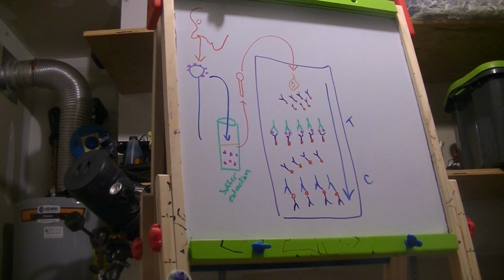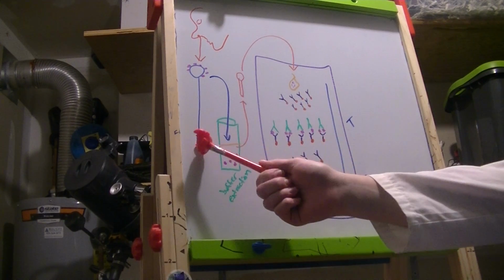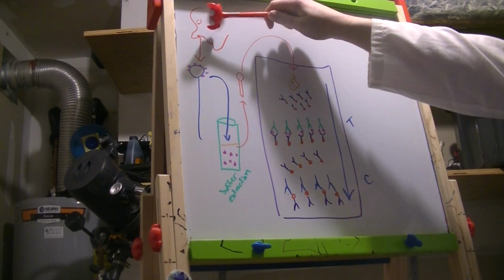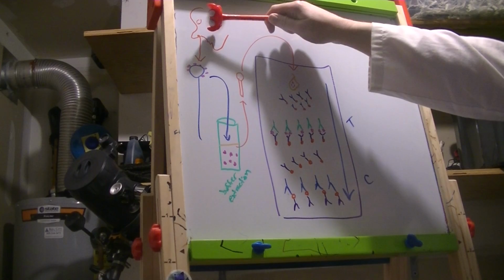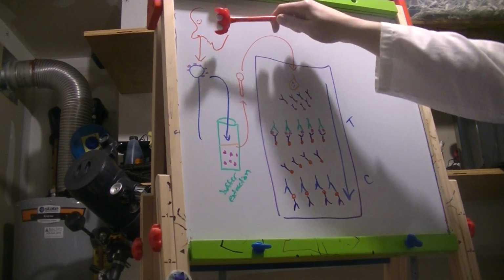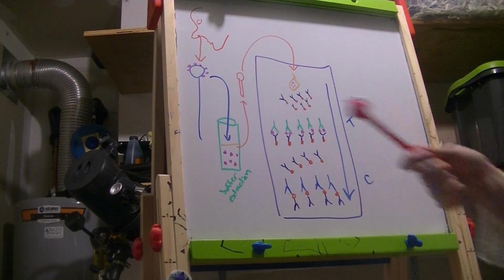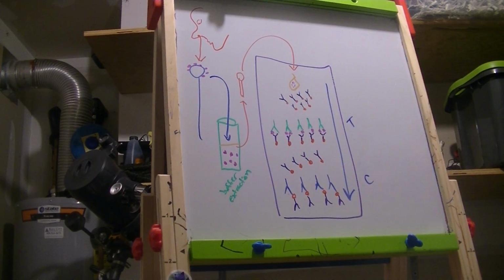This is the explanation of the principle for the flu A and B test we performed in lab. So this is performed on a nasopharyngeal swab, meaning the very back of the nose, where the nose and the throat meet, is where the swab will go. And if either flu type A or flu type B is present in that area of the patient, the flu antigens will be on the swab.